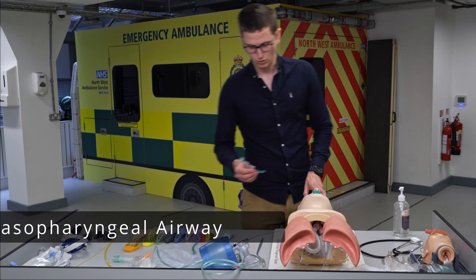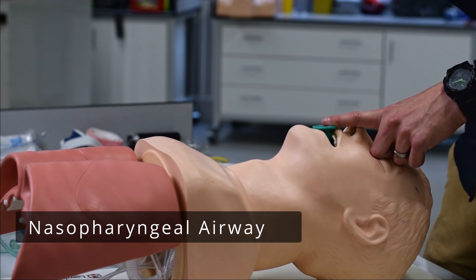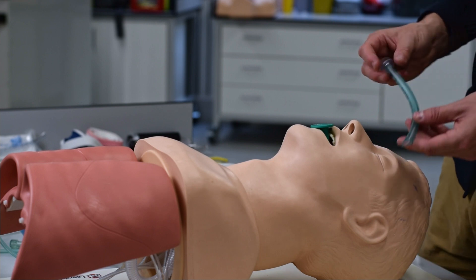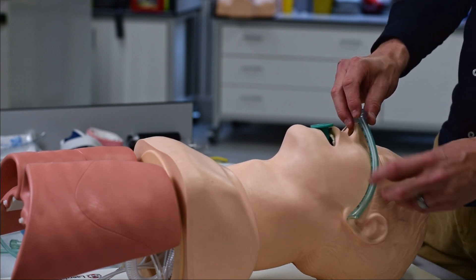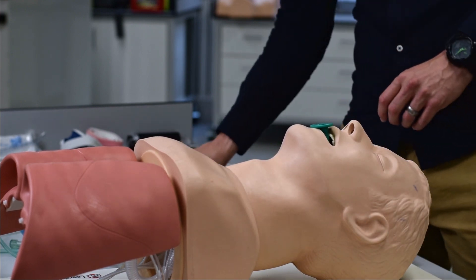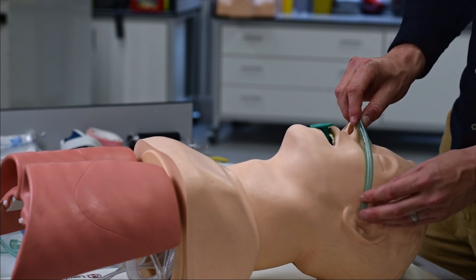Now let's go to the NPA, or nasopharyngeal airway. The NPA is nasal pharyngeal — it goes down the nose. How do we measure it? From the tip of the nose to the tragus of the ear. Measure it from nose to tragus.